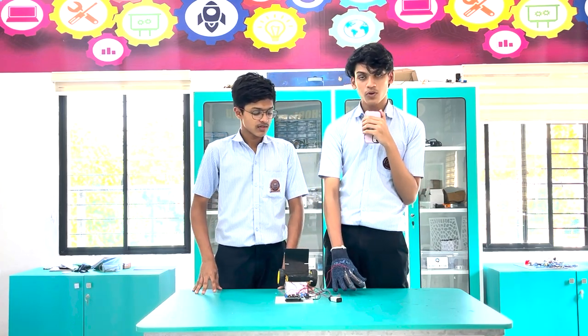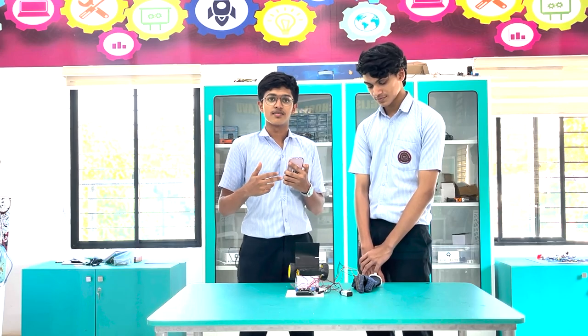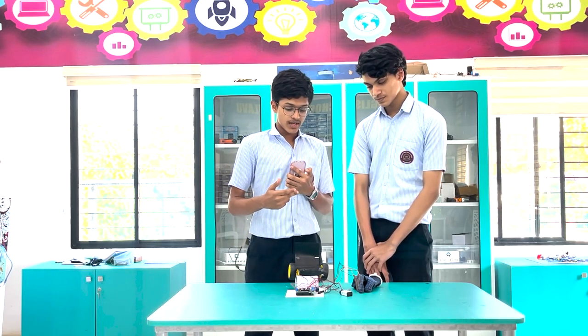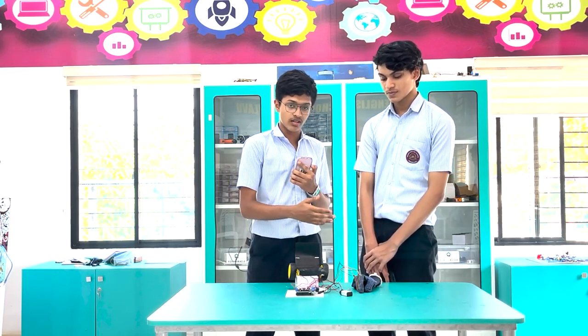You can configure it however you want and add more flex sensors to your liking. Some future enhancements include using this module wirelessly, which allows a seamless connection between the user and the wheelchair. We can also bring adjustable sensitivity to this hand glove.